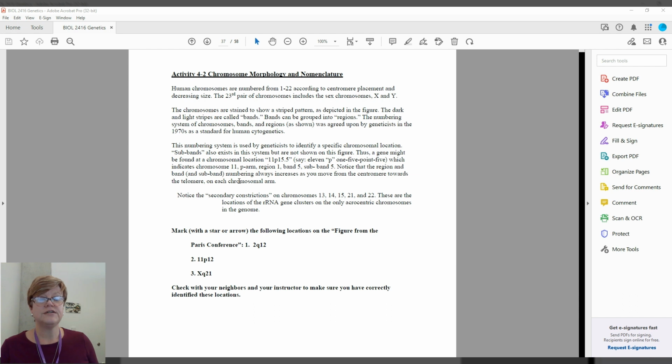So if I had a gene on a certain chromosome that I was interested in and I needed to call somebody and tell them about it, there was no way I could say it's chromosome 8 because that hadn't been decided on. So I would say it's a medium-sized chromosome with the centromere sort of in the middle. There was no standardized way to communicate things about particular chromosomes. So at the meeting in 1971, they agreed on this system. It's not something you figure out. It's just the system that we use. So once I show you the image, I'll show you how to use the system.